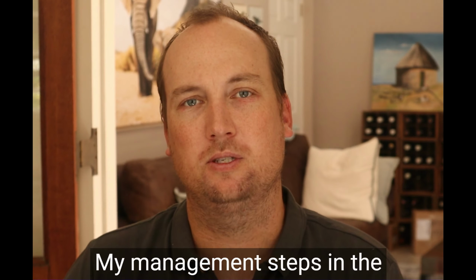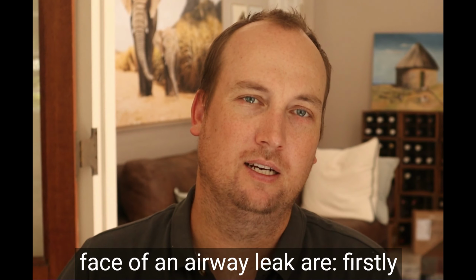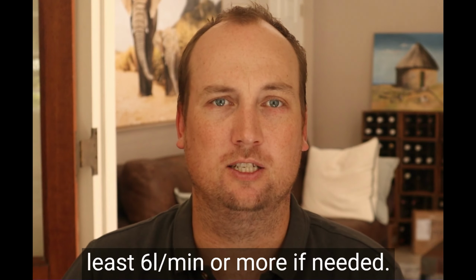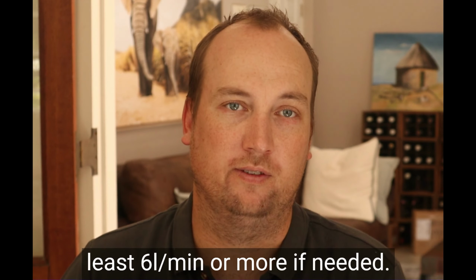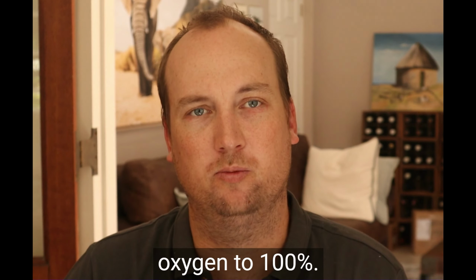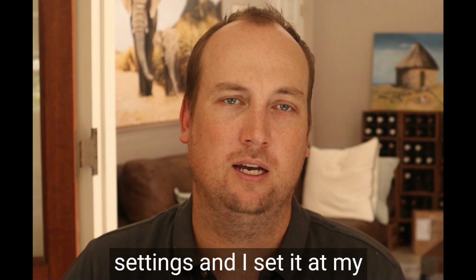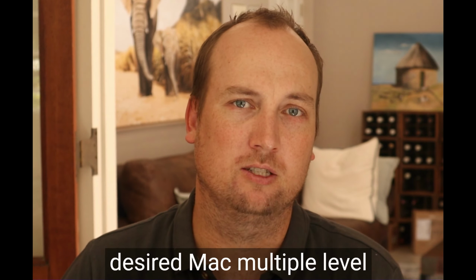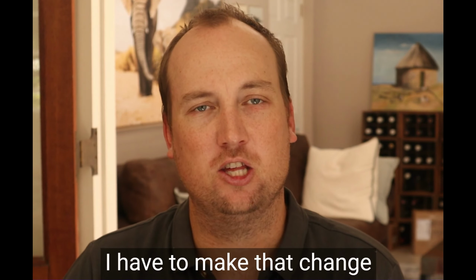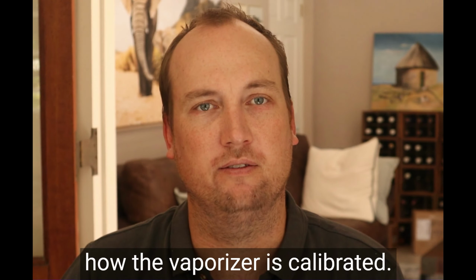My management steps in the face of an airway leak are: firstly, I increase the fresh gas flow to at least 6 liters per minute or more if needed. I increase the inspired oxygen to 100%, and I adjust my vaporizer settings to my desired MAC multiple level, which is usually 1 MAC.